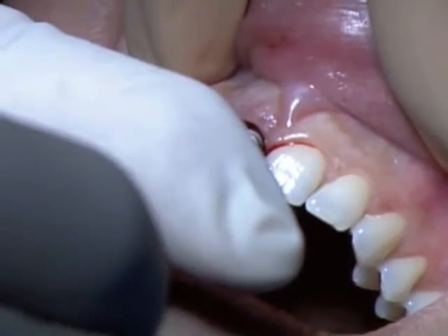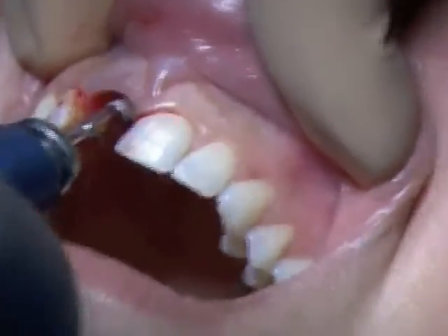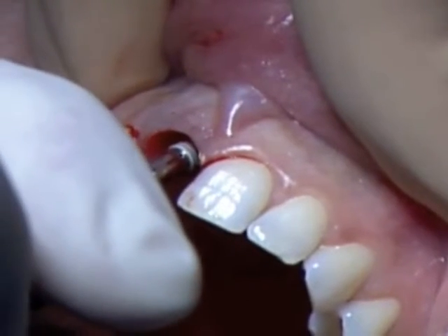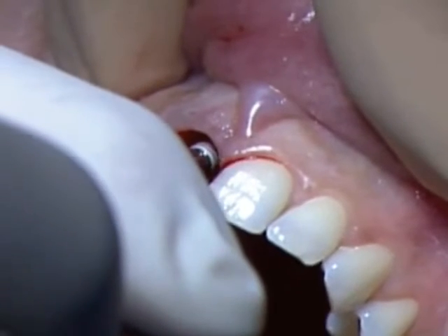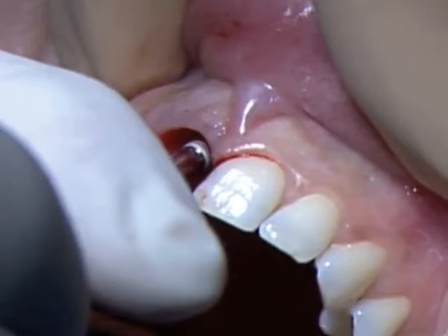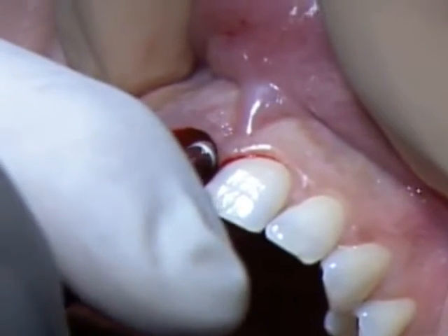The reason is that we have created a thin wall in between the extraction site and our osteotomy, and with rotary instruments we might destroy that. So I always use a straight handle, and my left hand index always protects me from misguiding the implant apex to this thin plate.